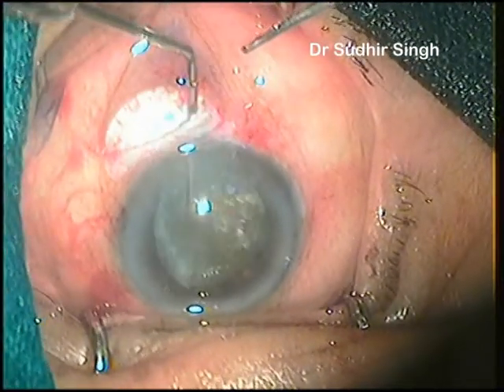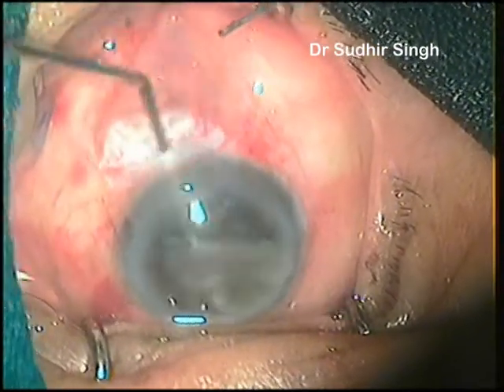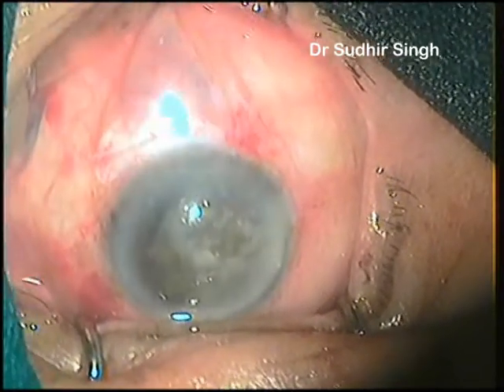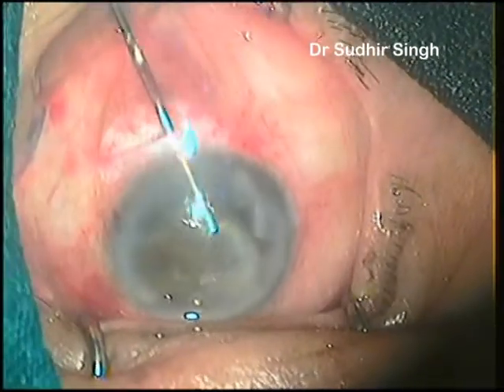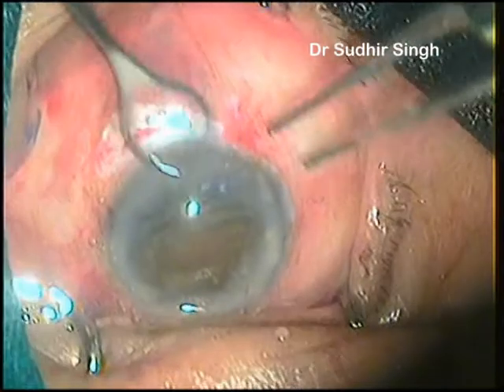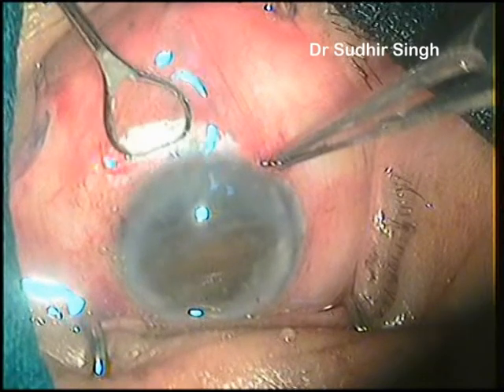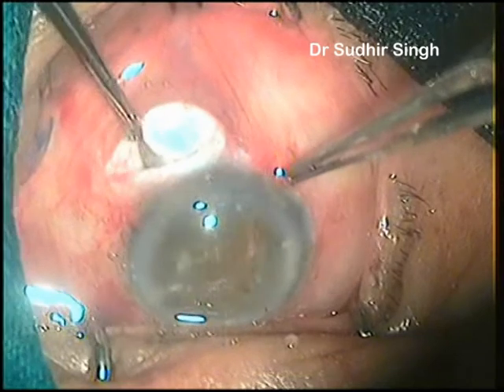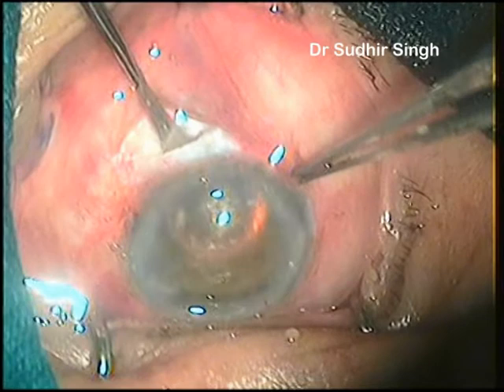After performing the hydrodissection, the lens nucleus is prolapsed into the anterior chamber with the help of the Sensky's hook. Enough viscoelastic is placed on the superior and inferior surface of the nucleus, and the iris is pushed back. The vectis is introduced by pressing the posterior lip of the tunnel, and the nucleus is taken in the lap. Then the vectis is pulled out parallel to the tunnel floor along the nucleus while simultaneously keeping the posterior lip pressed.